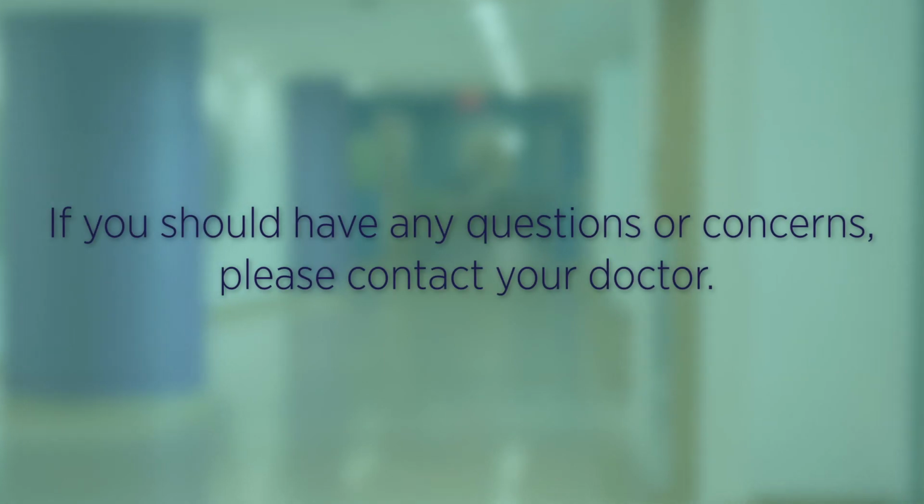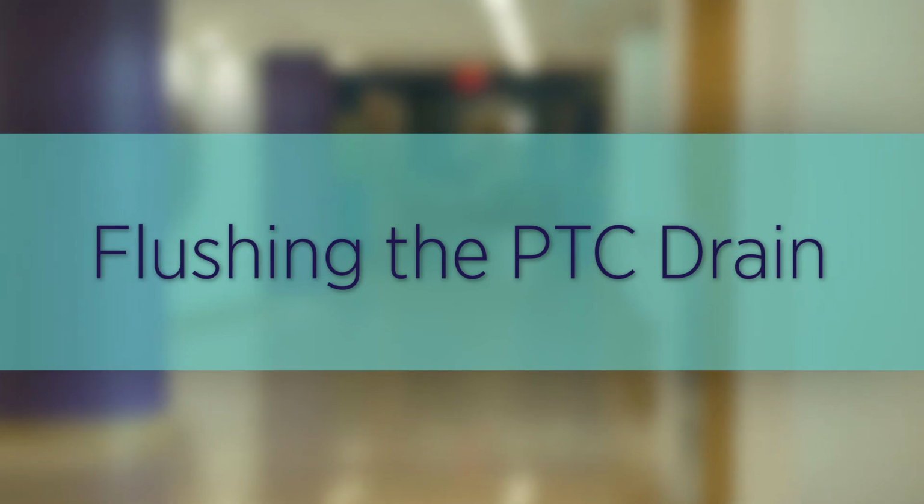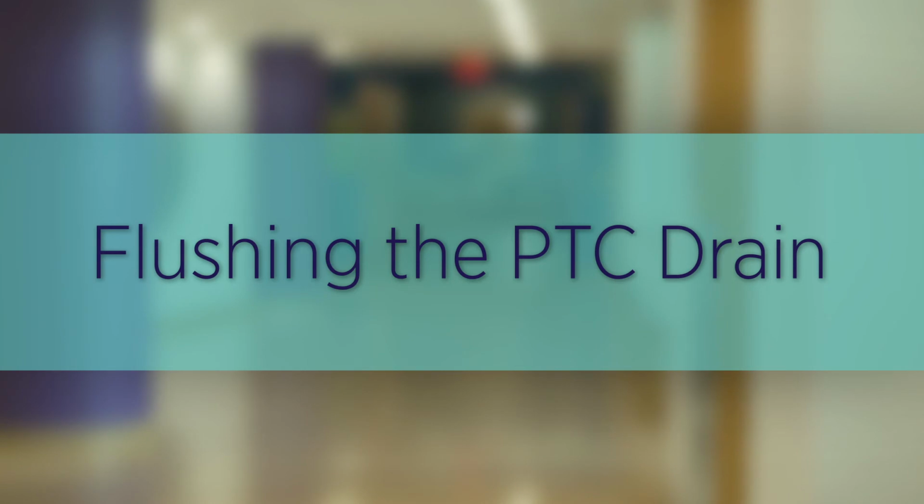If you should have any questions or concerns, please contact your doctor. Flushing your PTC drain. Flush the drain only if instructed by your doctor, and use the amount given to flush the catheter.